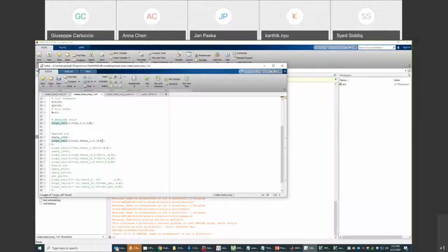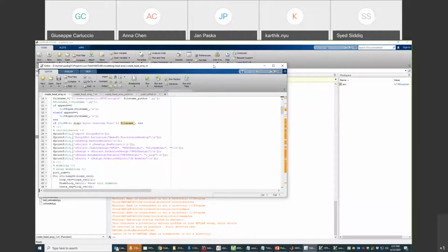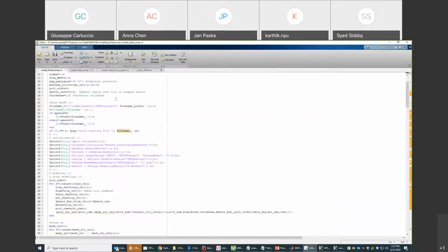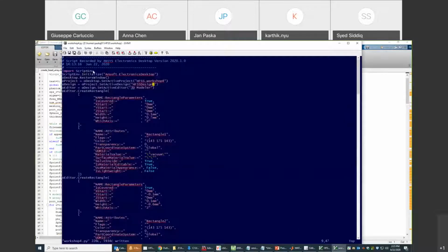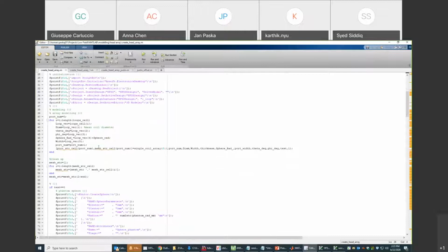So those are the four parameters that describe the coil, and then those parameters are given to a second subfile. Let's see how that looks. And that file already has, you can see, create a text file. So I'm writing into a text file, and I'm giving it a name, head array model. And there I will basically write those script commands that HFSS wants to see. If you see here at the top, that's exactly what's here. Script import script ends. So I just write that, and then I'm running through a loop, and that loop creates more of this text file.